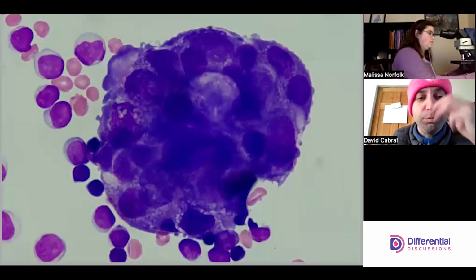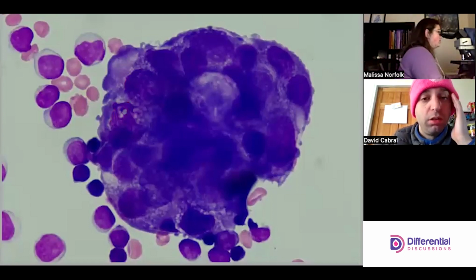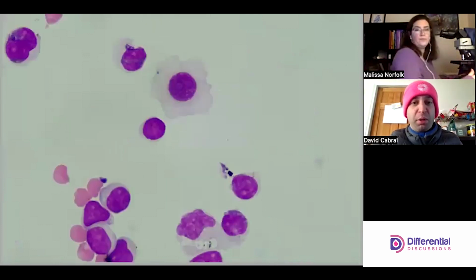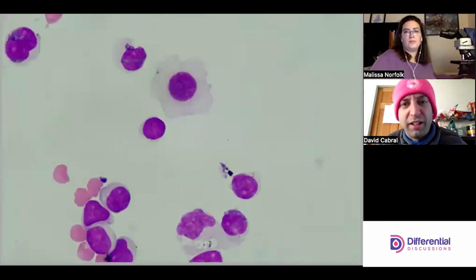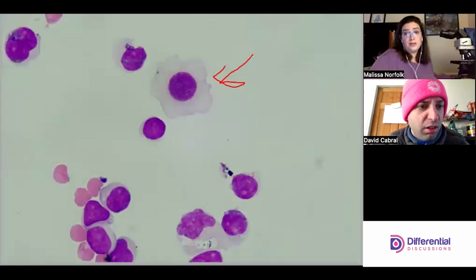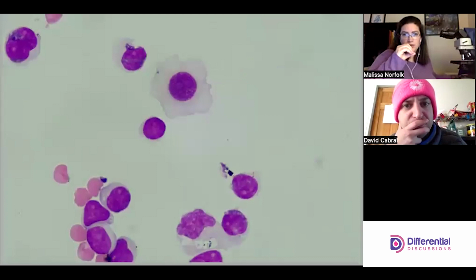Yes. Yep. All right, let's move away from it so we can see what else we're dealing with. Because while it is an important finding, it's hard to do a diff where we were, right? Like that's just not possible. Oh, how pretty. So that looks like a totally cool meso, right? I think so. And it's a little light. It's light, but the really, really round nucleus screams more meso than it does mono. Especially with that NC ratio, right? Yep. I tend to agree.